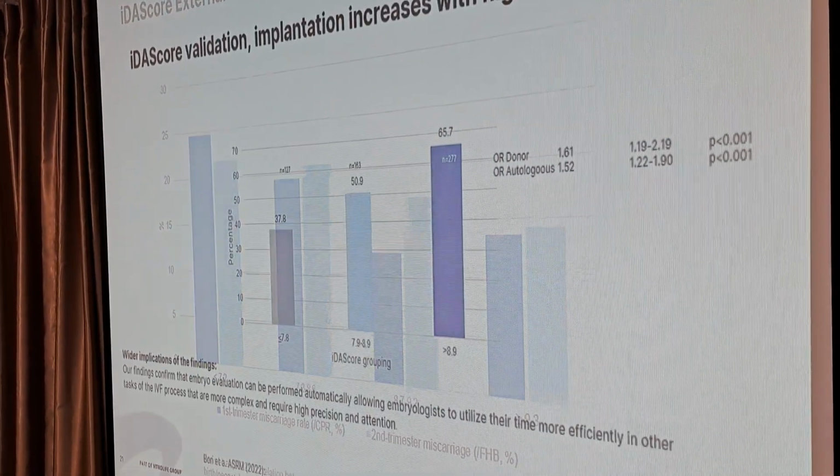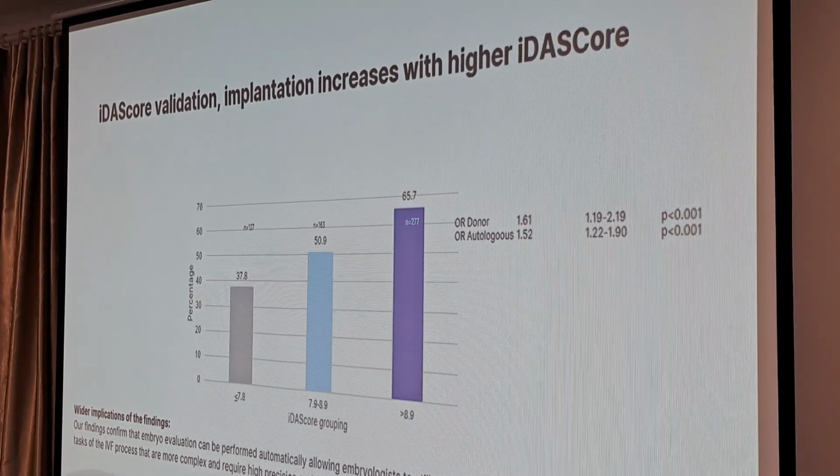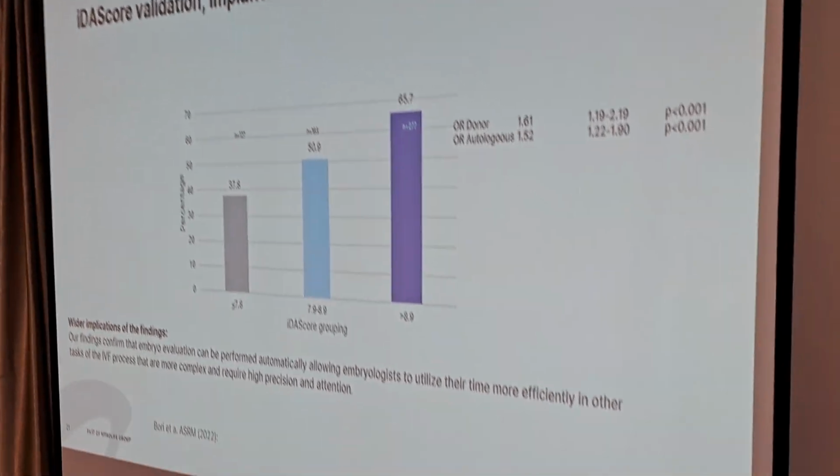And also for implantation, the higher your iDAScore, the higher the chances for implantation.